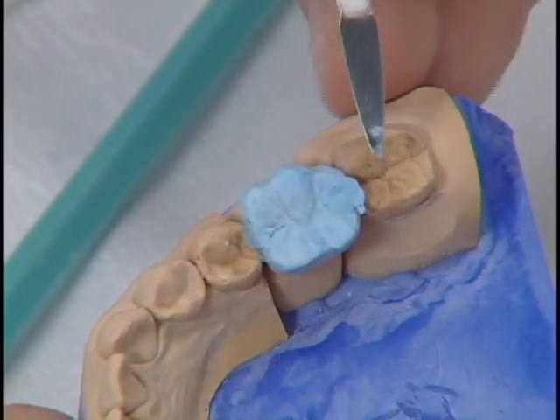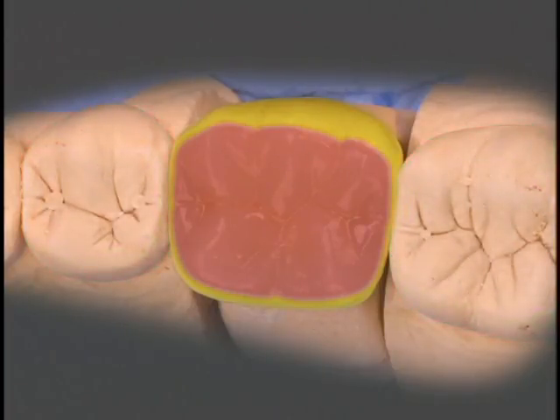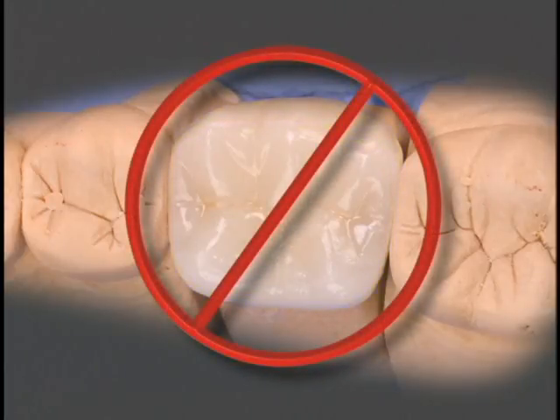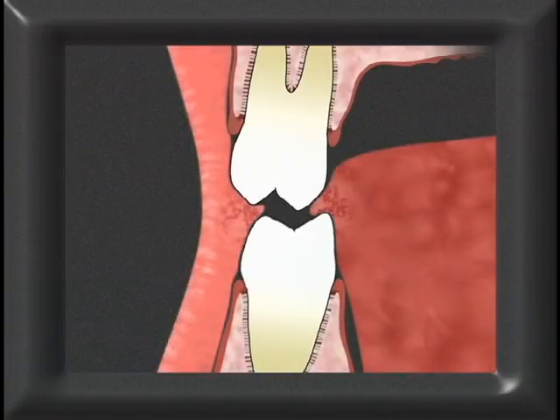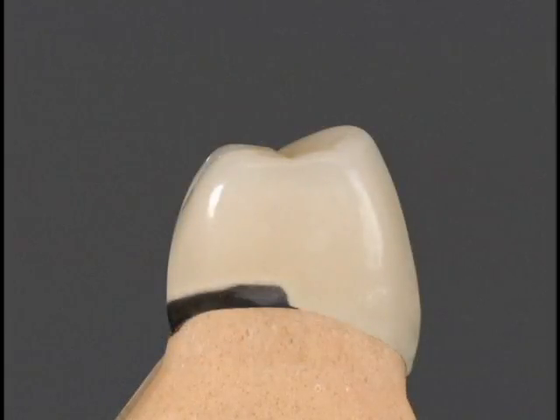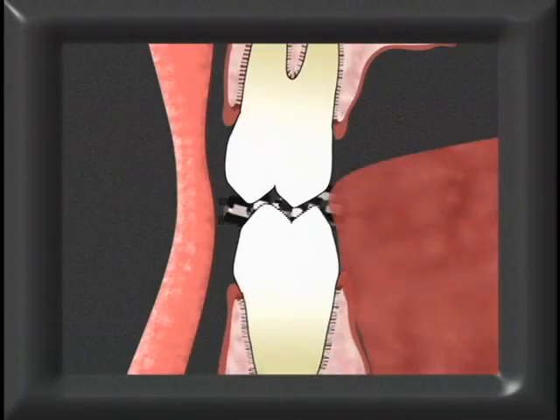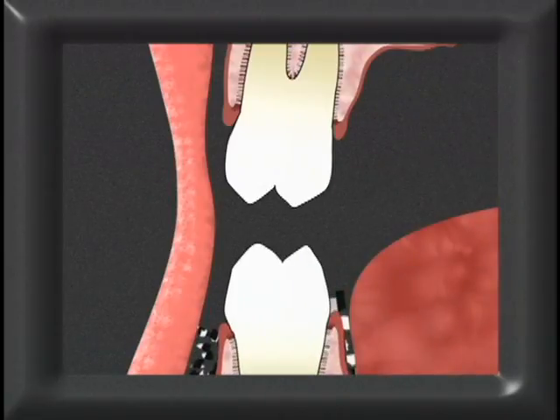Unfortunately, lab technicians tend to make crowns and pontics too wide when compared to natural dentition. When the occlusal table is almost the same diameter as the buccal lingual height of contour, it places the chewing surface too close to the cheek and tongue and increases the occurrence of cheek and tongue biting. Another mistake occurs when technicians make the occlusal table too narrow and place it right in the middle of the tooth. This decreases the size of the chewing surface and makes it difficult for the cheeks and tongue to keep the food in the chewing cycle.